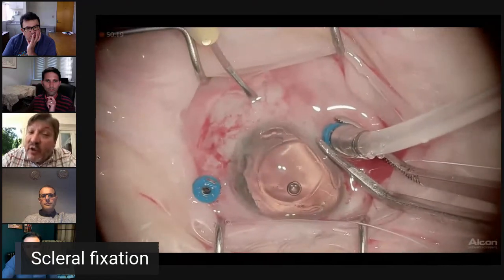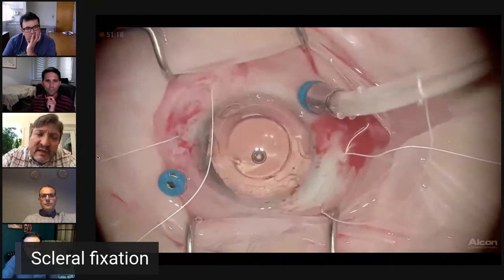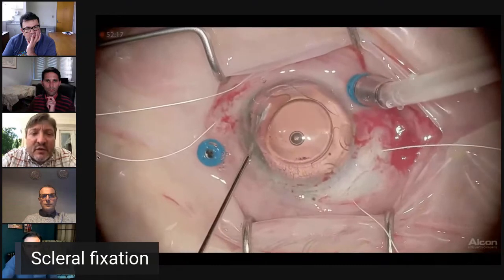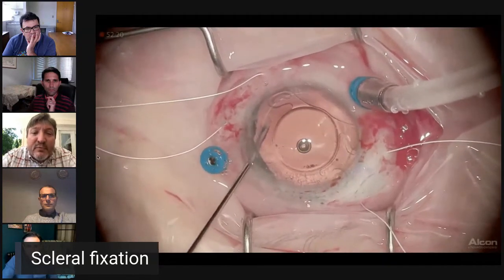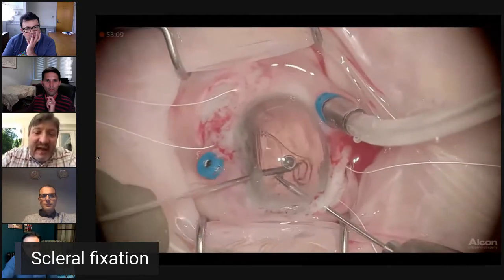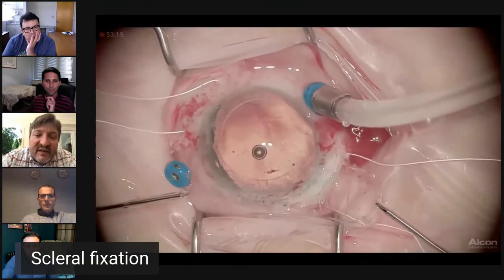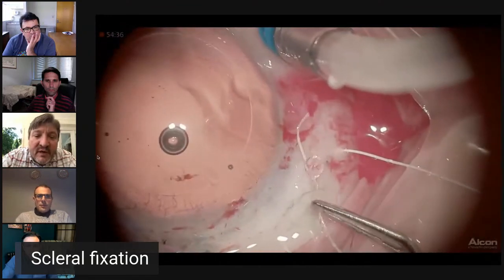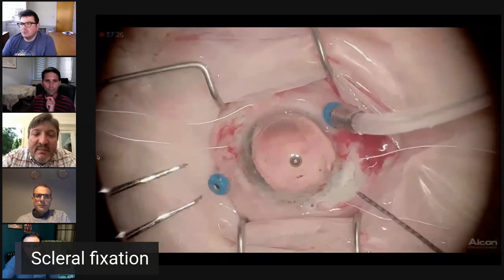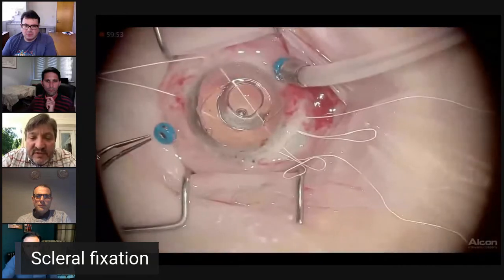The conjunctiva is open here, as we had just talked about. And again, another loop of Gore-Tex into one sclerotomy and out the other sclerotomy. Now watch what happens as I cut the Gore-Tex. 1, 2, 3, boom. You see the tension that got relieved? That's why this eye couldn't see. And so we cut the other Gore-Tex. I've got the offending lens in my forceps. We remove it. We take the old Gore-Tex sutures out because I'm a little OCD. We measure the anterior chamber. We externalize the Gore-Tex suture loops.